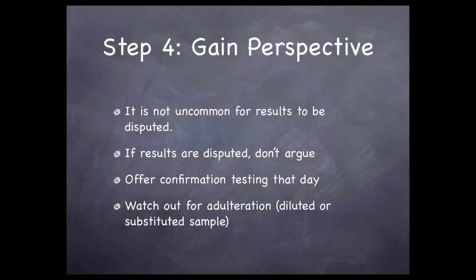One other note regarding the collection of urine to perform this test. There is the possibility that your teen is committed to continued use of tobacco and may attempt to avoid your consequences by attempting to substitute, dilute, or adulterate their sample. If you suspect that your teen is highly likely to substitute someone else's clean sample or add adulterants to try to mask their usage, then you may choose to observe them as they fill the clear collection cup with the temperature strip that we provided to you.